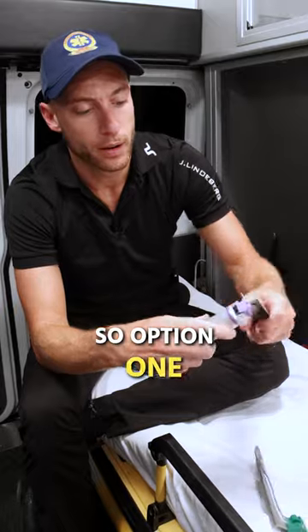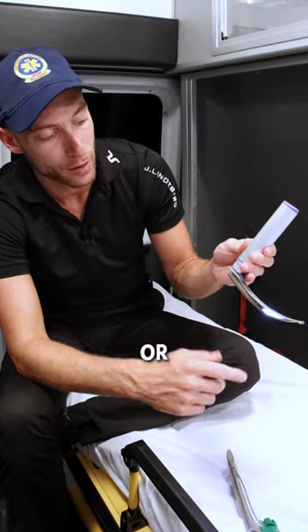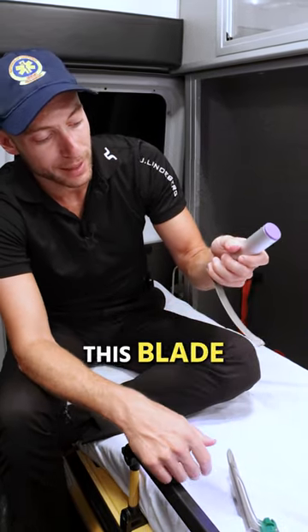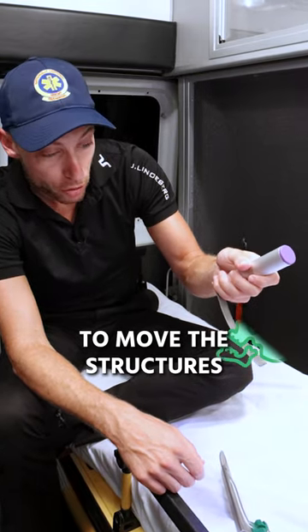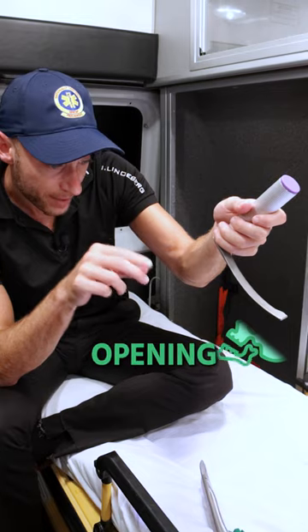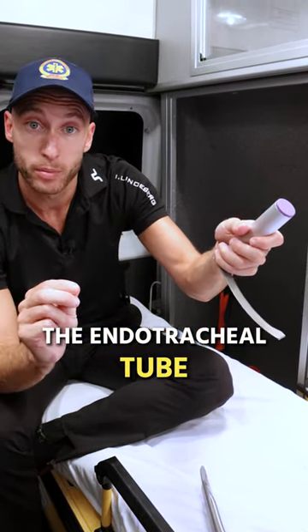So option one, what we have here, this is called a MAC blade or a Macintosh blade. It is a curved blade and we're going to place this blade into the patient's mouth to move the structures out of the way so we can see the laryngeal opening. And through that laryngeal opening will go the endotracheal tube.